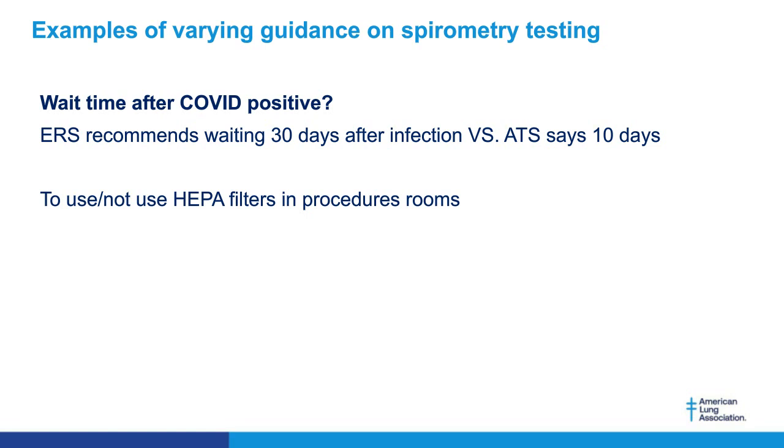Anyway, the European Respiratory Society in a very early statement said, wait 30 days after infection. This was one of the first ones that came out. The statement that just came out, July 14, 2020, ATS says wait 10 days. My infection prevention department said, Ed, we're asking everybody for everything else to wait 21 days. Can we just do that for spirometry and pulmonary function testing? And so, of course, I agreed. 21 days is somewhere between 30 and 10, so I figured, why not? So at the University of Minnesota, we're waiting 21 days after infection.